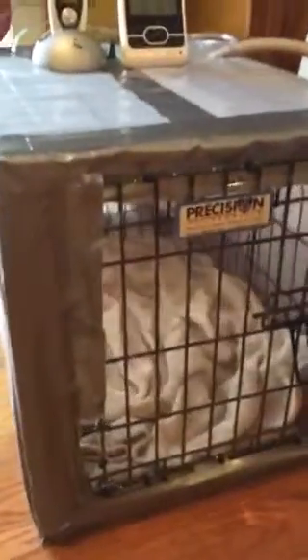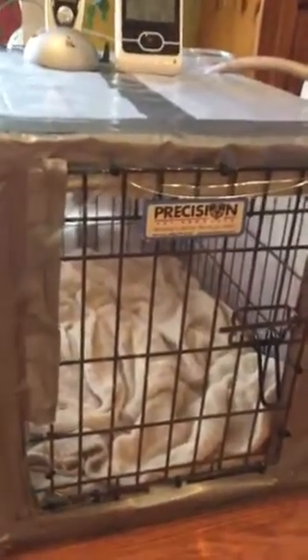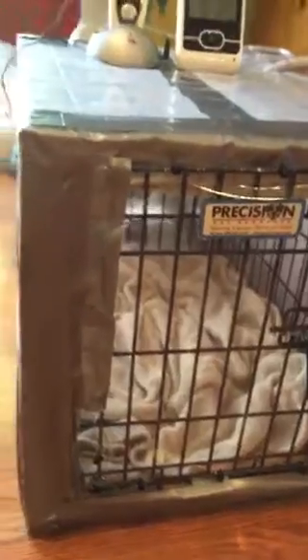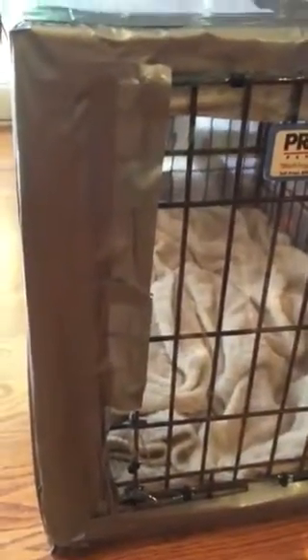Plus, in the front of the cage, that is clear plastic over the door. I did have a small piece that I was able to tie wrap on so my dog can see out. Now on the bottom of the doorway, actually right here, you can see I did have a couple airways there also that the respiratory therapist felt I should block the top part because it was just a little bit too much ventilation. So there we have that.